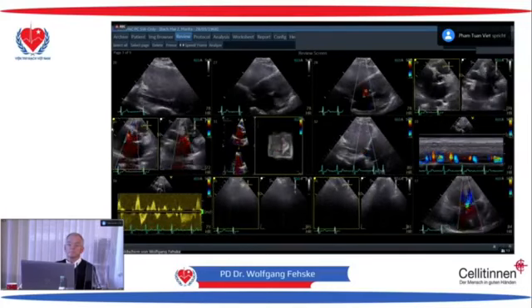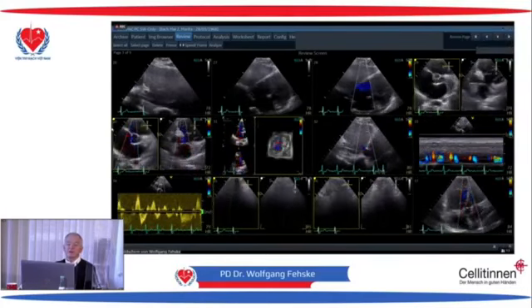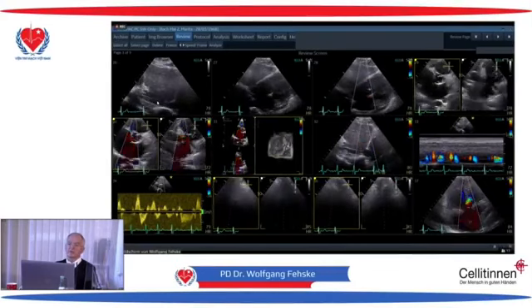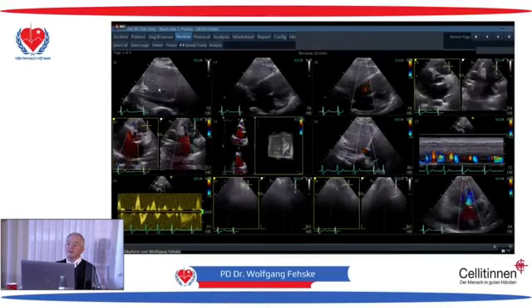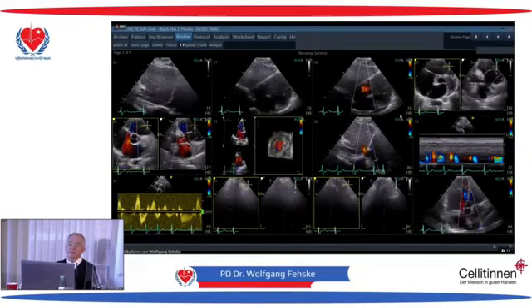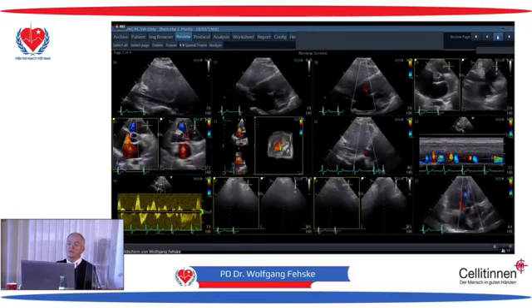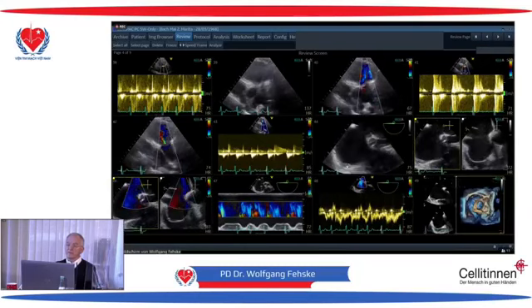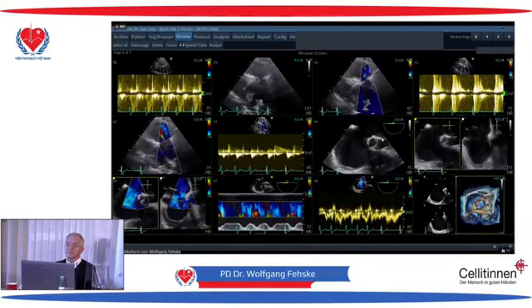So as before, we look for the venous congestion. There is no venous congestion. Everything is okay. And we are looking transthoracically again for the ASD. But I'm absolutely sure that we will go to the transesophageal echo. I go directly to the transesophageal part of it.